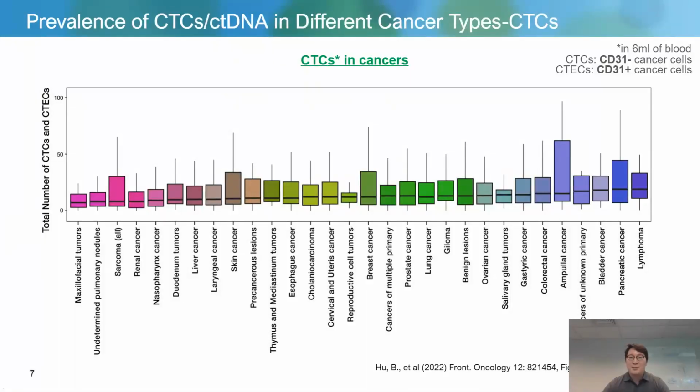To make liquid biopsy possible, we should be detecting a scalable level of certain tumor markers for actual cancer studies. In a recent paper, researchers obtained a peripheral blood sample from over 2,000 patients with different cancers, and the first thing they did was to get rid of other blood cells, such as RBC and WBC, via centrifugation. They also used a magnetic bead that can bind to the leukocytes, and finally, all the remaining cells were stained manually to see individual rare cell populations.